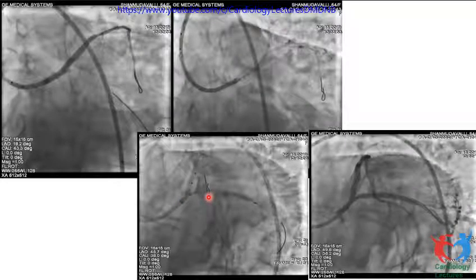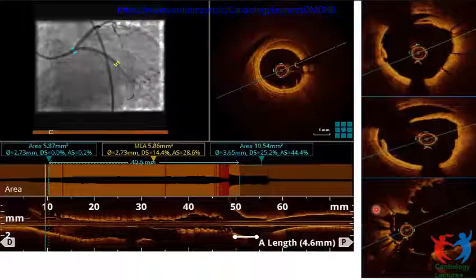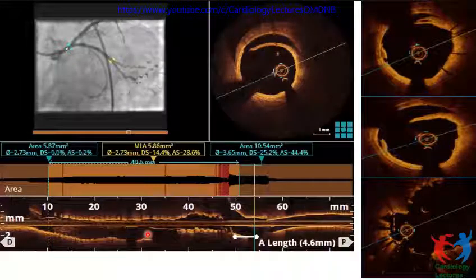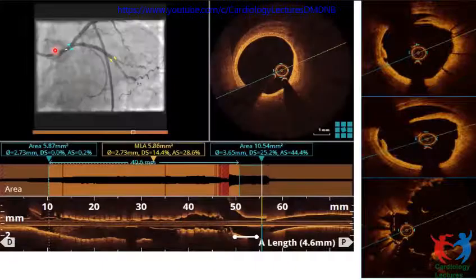And then after stenting that, I went ahead and did an OCT to see what was happening. So this is what I could see. The stent was well deployed, but in the proximal segment in the LAD, there is a significant dissection here, which initially I could not pick up on an angiogram. But what we could make out is suddenly that LCX closed.